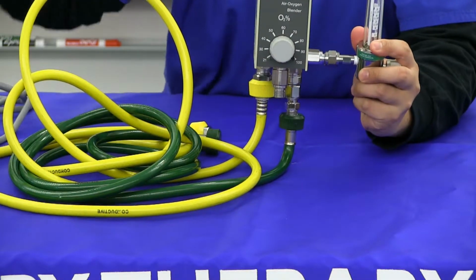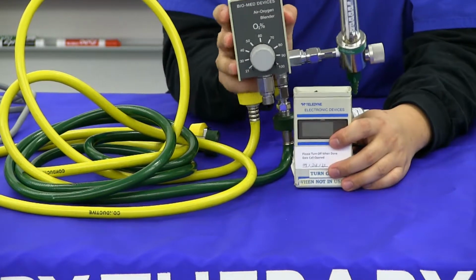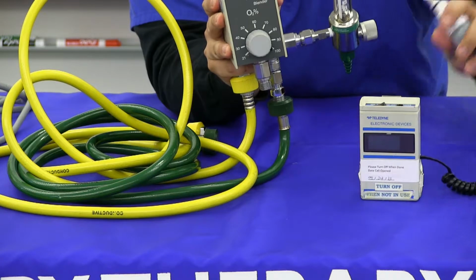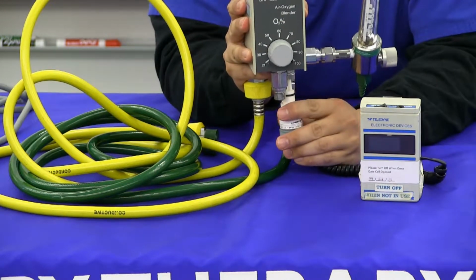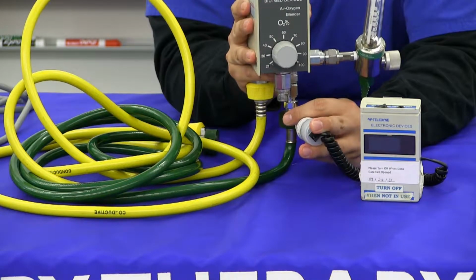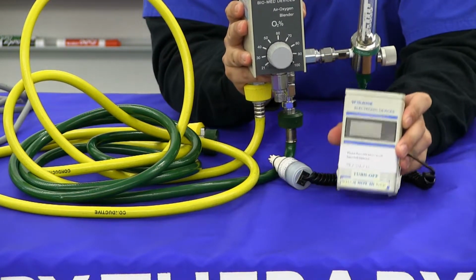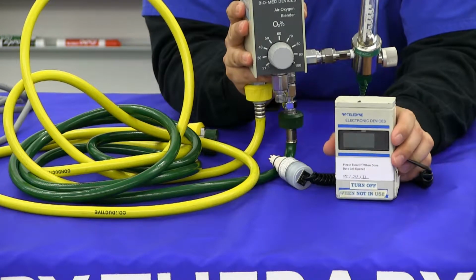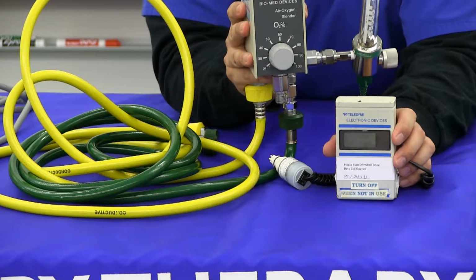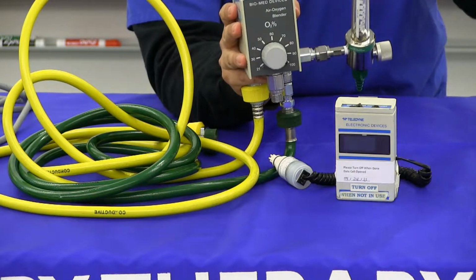Okay, and then next we have your oxygen analyzer. Usually the probe on this oxygen analyzer will sit somewhere on the bottom where the outlet is, and it'll be sampling the oxygen that's passing through the line as it's going in. So you'll get a live readout of what kind of FiO2 you're getting from your blender, because the blender may be plus or minus 1%, just depends on how often they've been calibrated. Okay, and then from here, your line will connect to your dry side circuit.